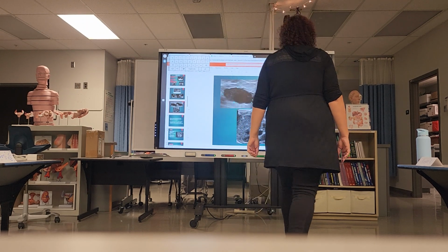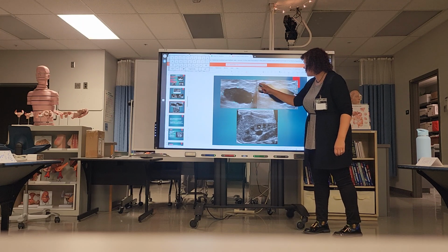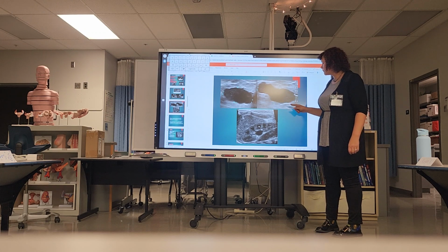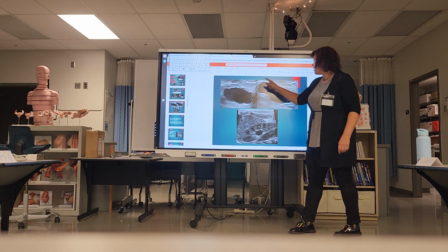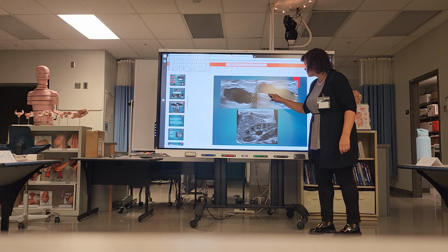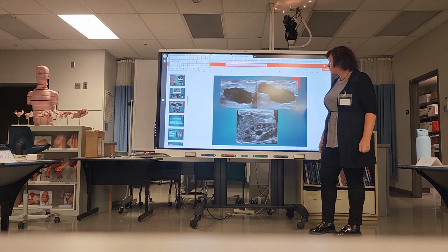What would you call it? Borders. Okay, so how would you describe these borders here? Poorly circumscribed. I mean, they look smooth, but they're irregular. Definitely irregular. So you can put calipers on this real easy, but they're definitely irregular, and this is called lobulations. Okay. Hypoechogenicity.